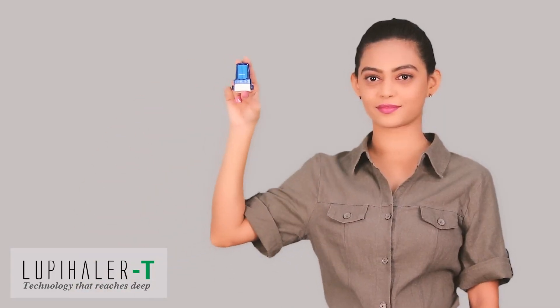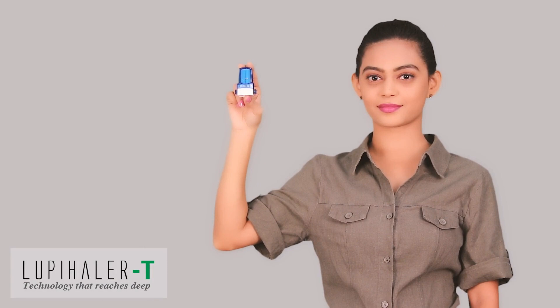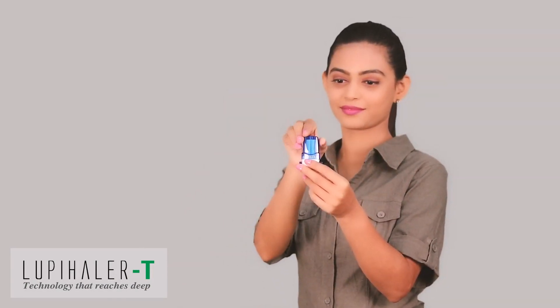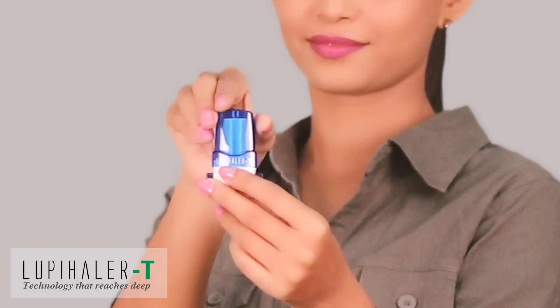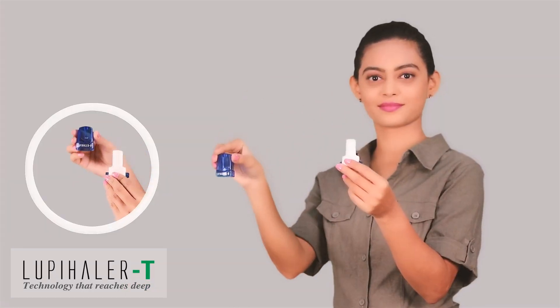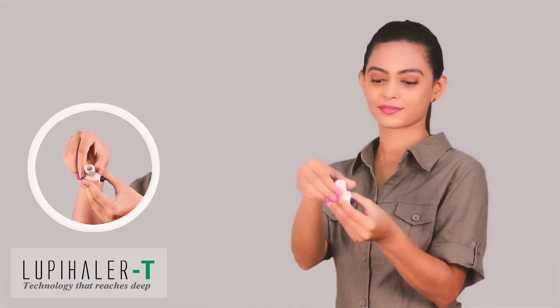Dry Powder Inhaler DPI. Let's start with understanding the parts or components of a Dry Powder Inhaler Lupehaler T. This inhaler consists of three main parts: Dust Protecting Cap, Mouthpiece, and Capsule Chamber.